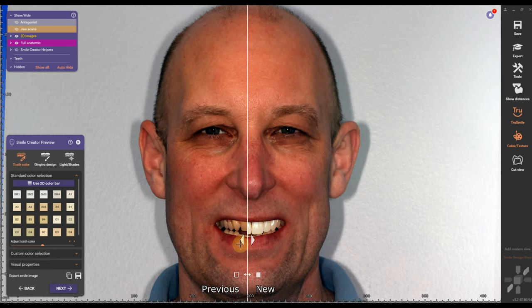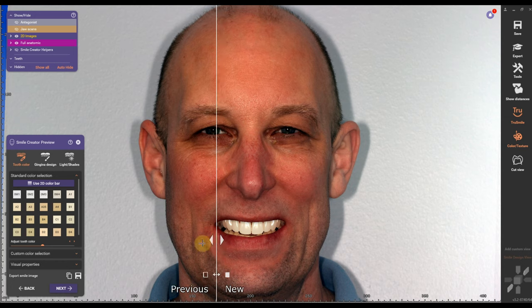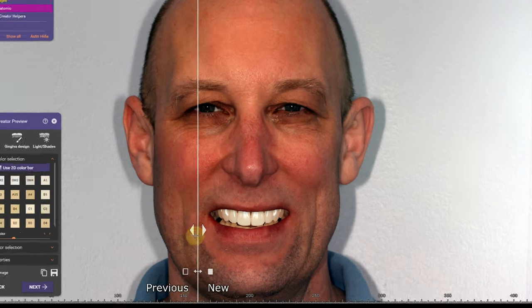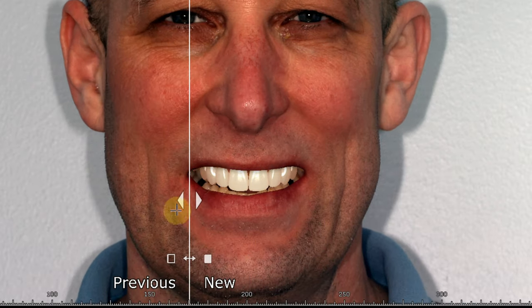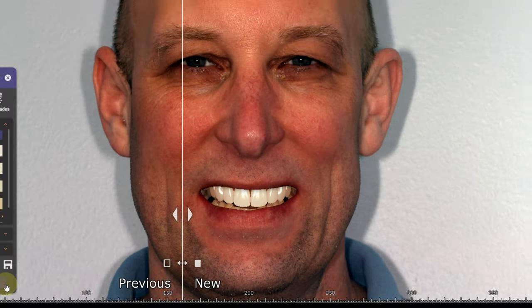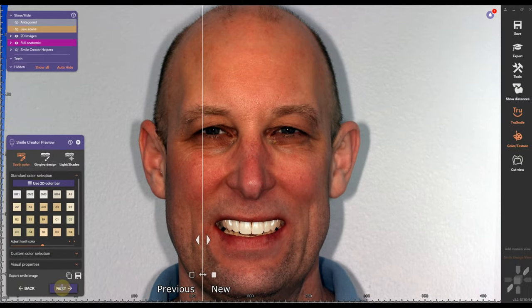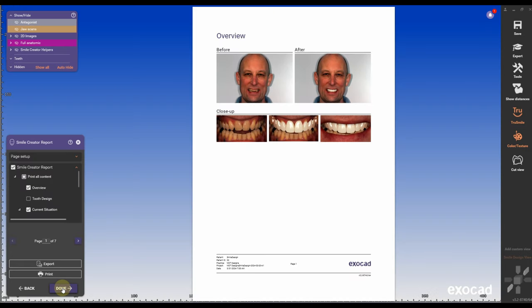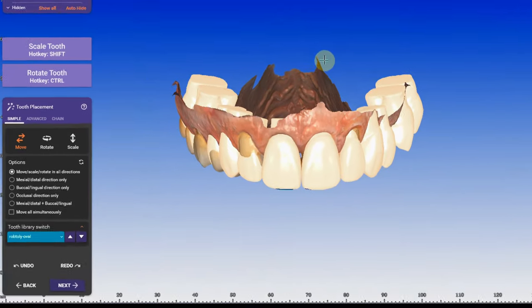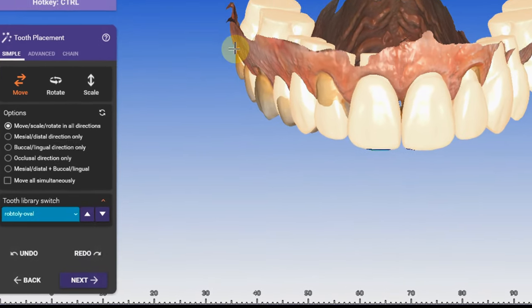In the first preview, you have a before and after — previous and new design. You have a slider, you can slide back and forth. I can then create a PDF. I'm gonna go through the PDF later in the video in more detail. But now I'm going to position my teeth first in chain mode.